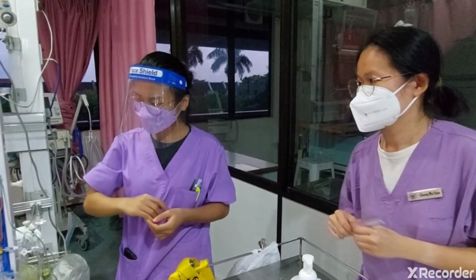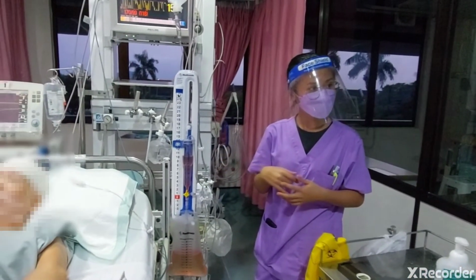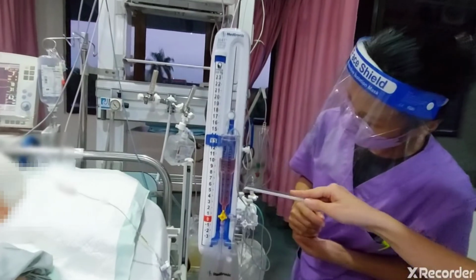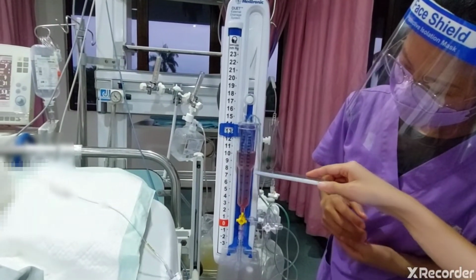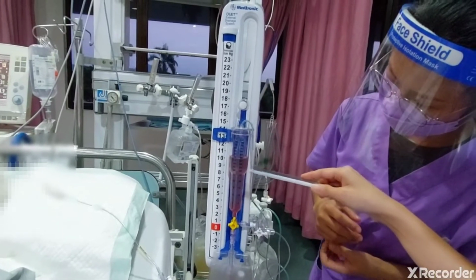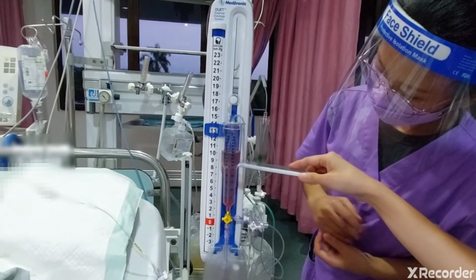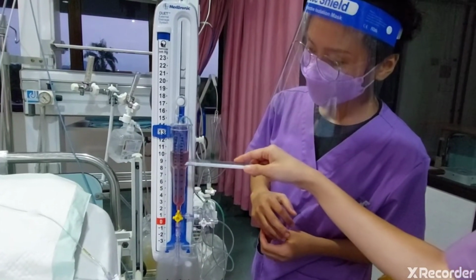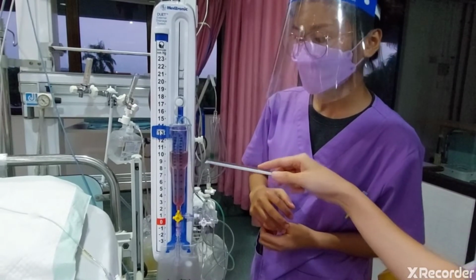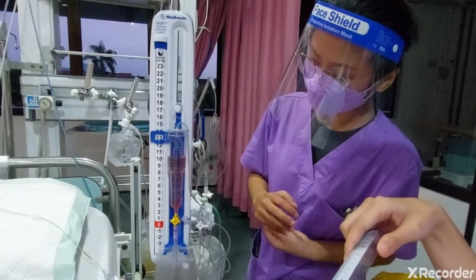So what do we actually need to monitor from here? The abnormalities. This is the CSF from the brain. So we need to monitor if there is any blood stain. Heavy blood stain from here indicates there's a hemorrhage, so we need to inform the doctor. Or any cloudy color changes. If it's cloudy, then we need to inform the doctor. Maybe it indicates an infection is going on. And how much is the drainage? We need to inform the doctor.